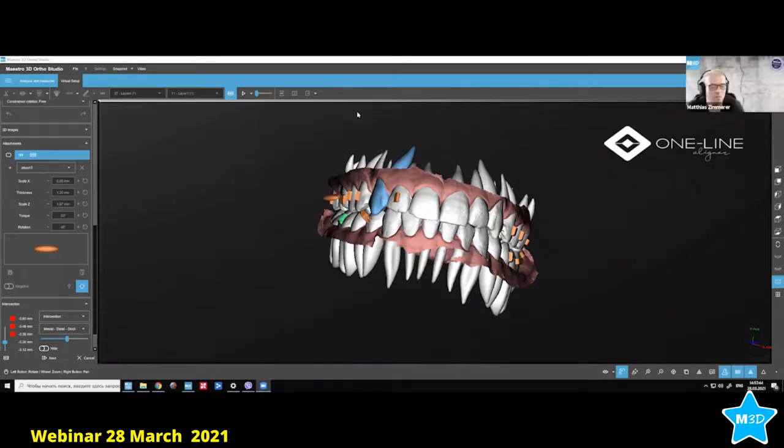Another question: how do you remove it after the suck down? This is what I answered just now. You remove it like all other attachments. There's no problem at all. Especially if the sheet has a protective foil, it comes out more easily. Duran from Scheu Dental doesn't have a sheet, so it sticks to it and then it breaks off. But with the Pro Plus, it has a protective sheet, so it's not really a problem.